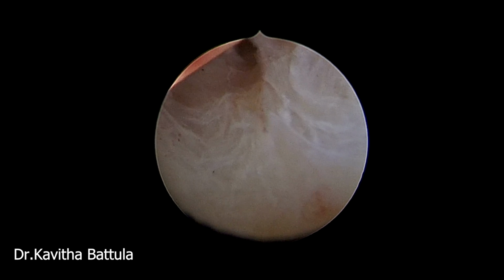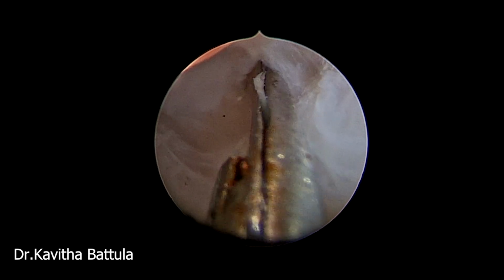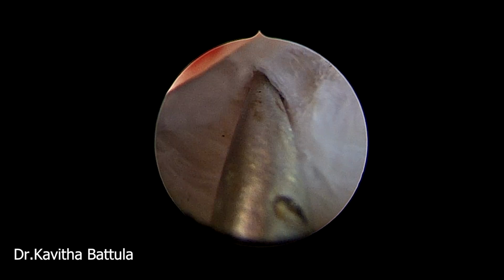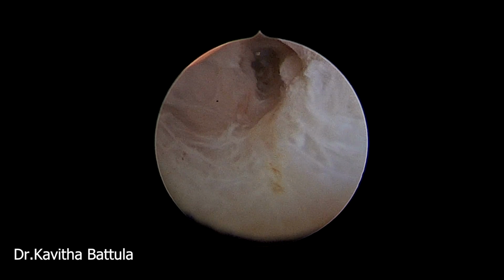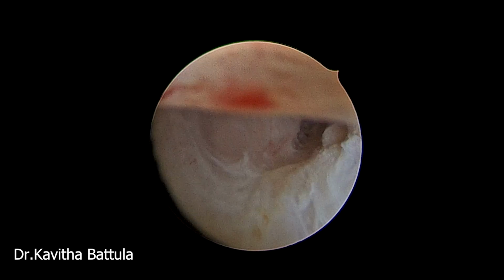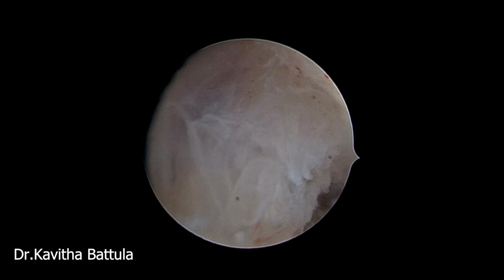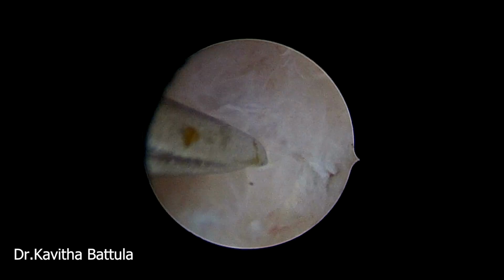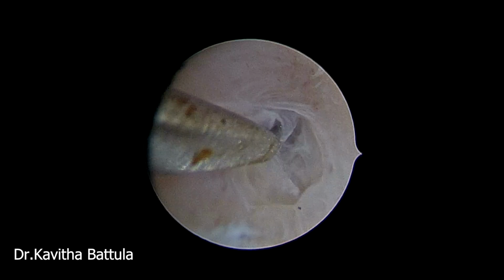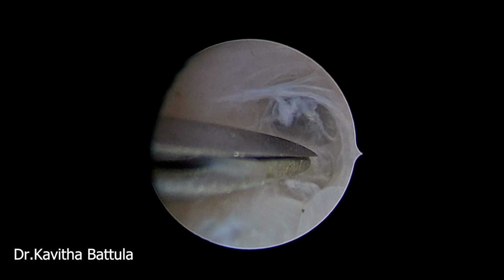There are two on either side. It was something like this: the right side was not so appropriate, not so correct a cavity. So we are trying to go to the other side. So this is the other side. We can see a film of tissue covering the cavity. Here we are trying to incise that film covering the cavity.